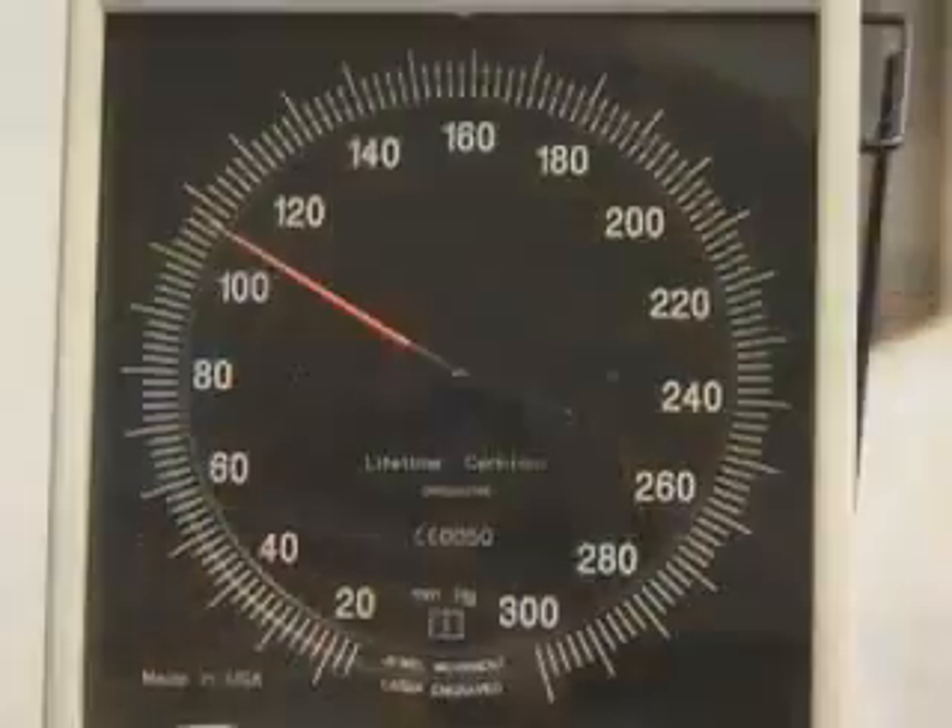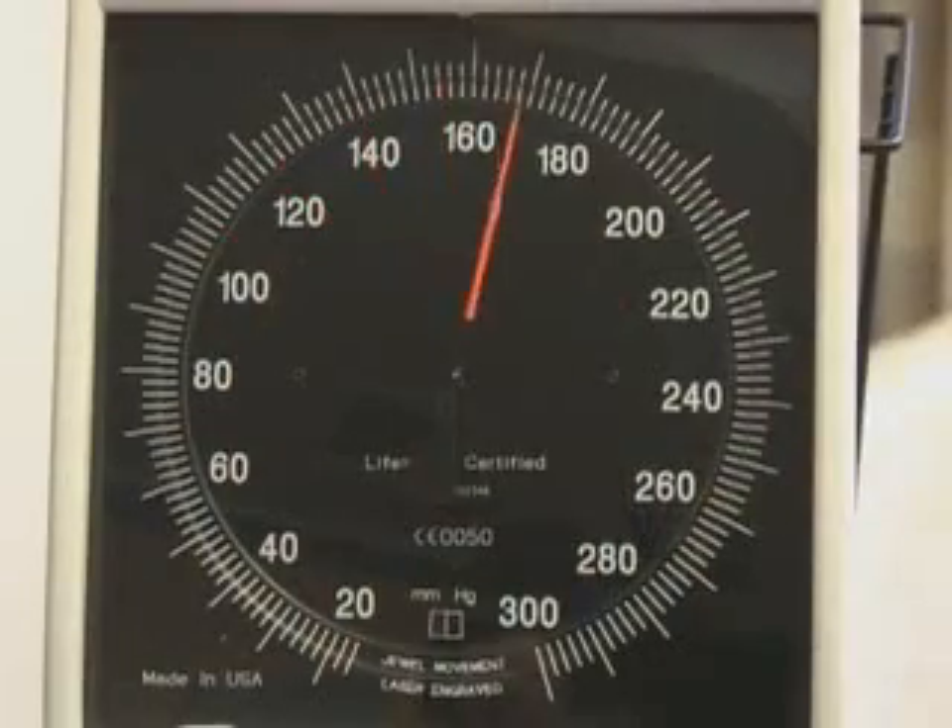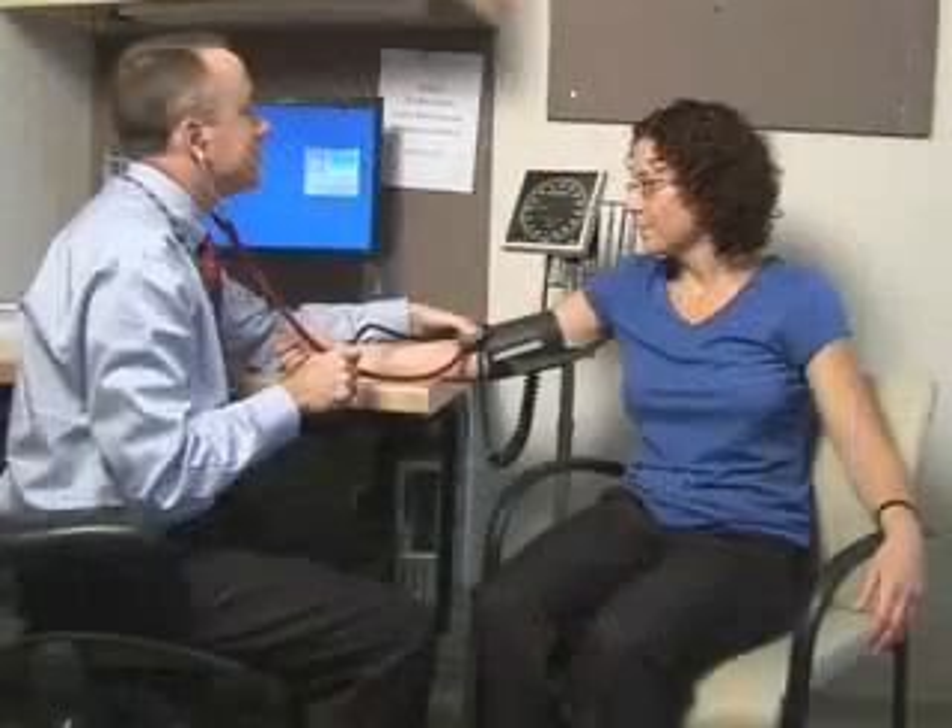This video provides the viewer with a standardized methodology that, when followed, will lead to accurate blood pressure measurement.